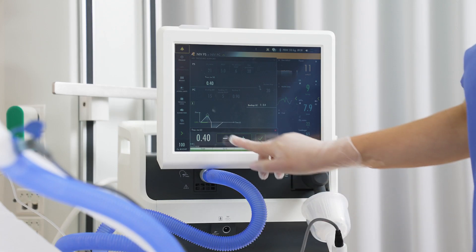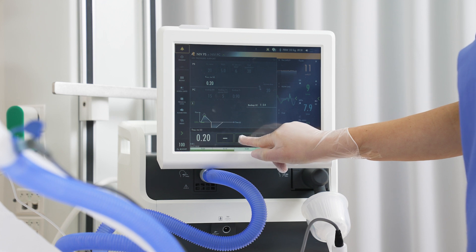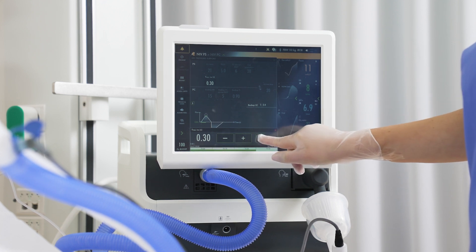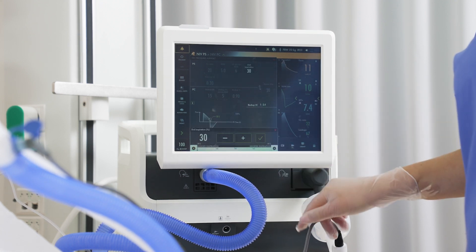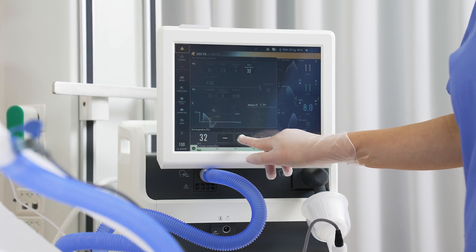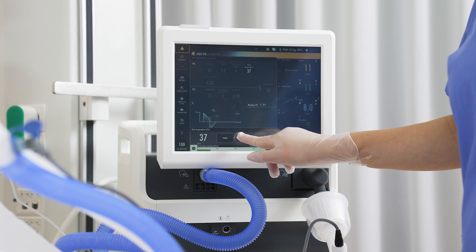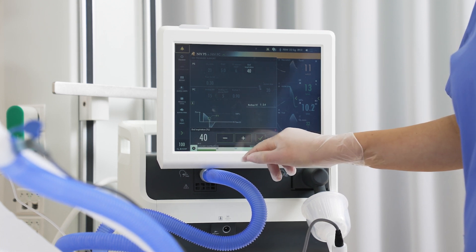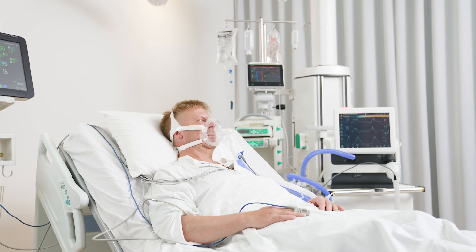The inspiratory rise time setting determines the amount of time it will take to reach the set pressure. Adjusting this value will allow for better synchrony and patient comfort. The termination of inspiration is determined by the end inspiration setting, which represents the percentage of end inspiratory flow compared to the peak flow. The higher the end inspiration, the shorter the inspiratory phase.